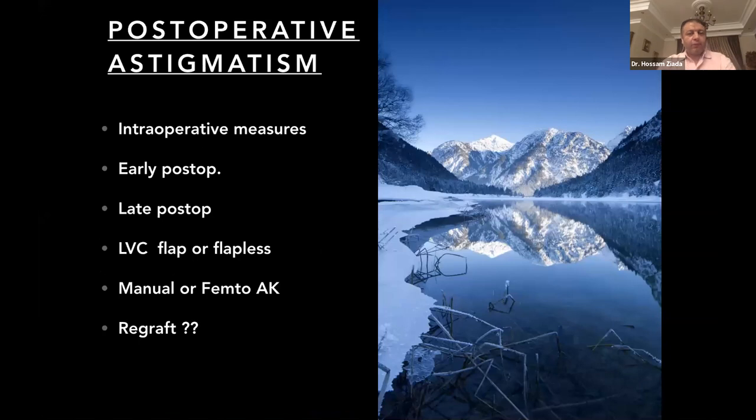Then, what about the postoperative astigmatism? I think we discussed this point, which is the intraoperative measures to decrease astigmatism, the early postoperative and the late postoperative after 3 months. Dr. Mahmoud showed that in his presentation. The question here is that laser vision correction is one of the options to correct postoperative residual error, either spherical or astigmatism. LASIK or PRK, flap or flapless?